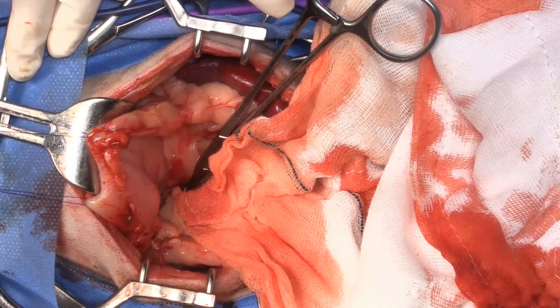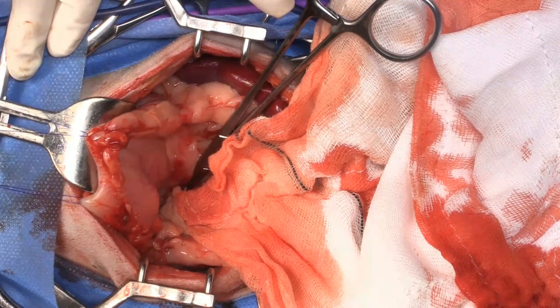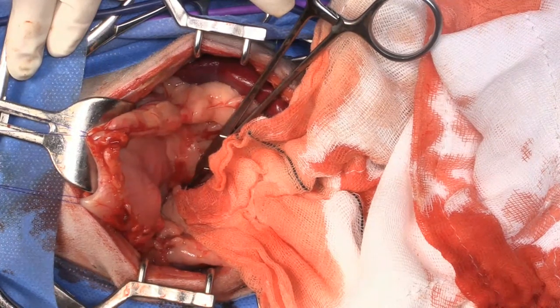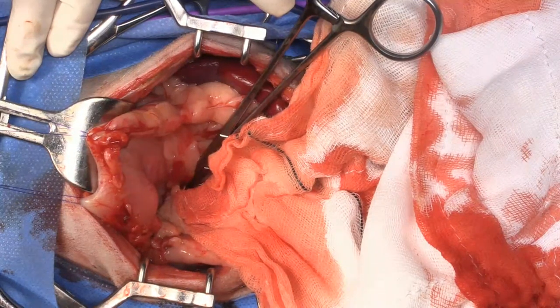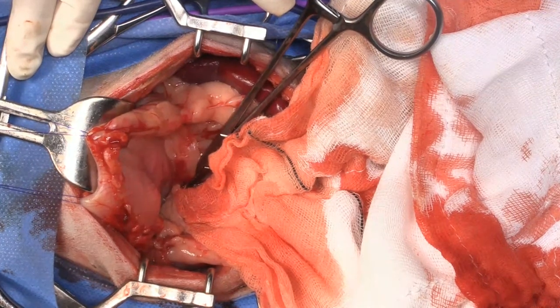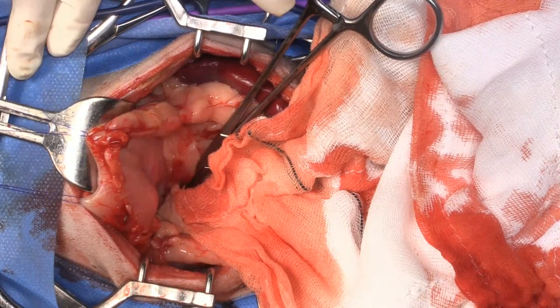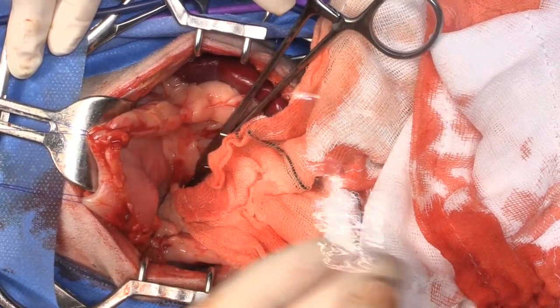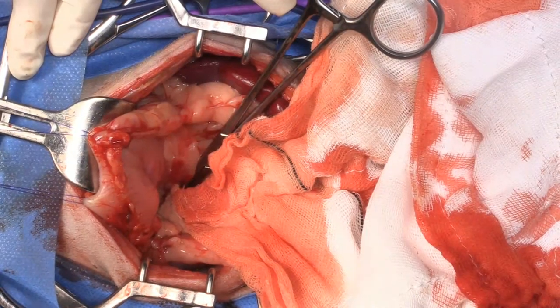So this is actual cellophane from a lolly shop. And you have to make sure that you use proper cellophane and not plastic, because only cellophane creates that response that causes occlusion of the shunt. If you use plastic, and I have purchased cellophane before, where I was told that it was cellophane, and then when we put it on, it never occluded, so I had to go back in with proper cellophane and redo it. So this is the cellophane here, and the way you can tell the difference between cellophane and plastic is that when you burn cellophane, it burns like paper, whereas when you burn plastic, it drips like plastic.